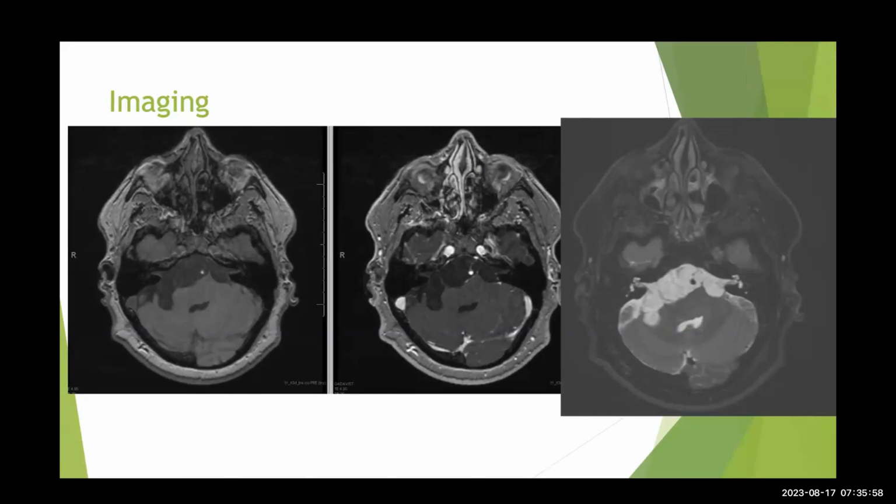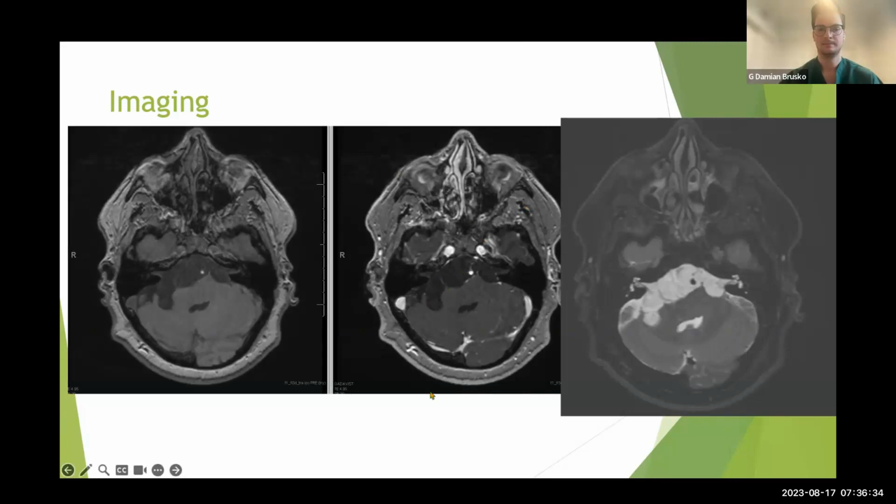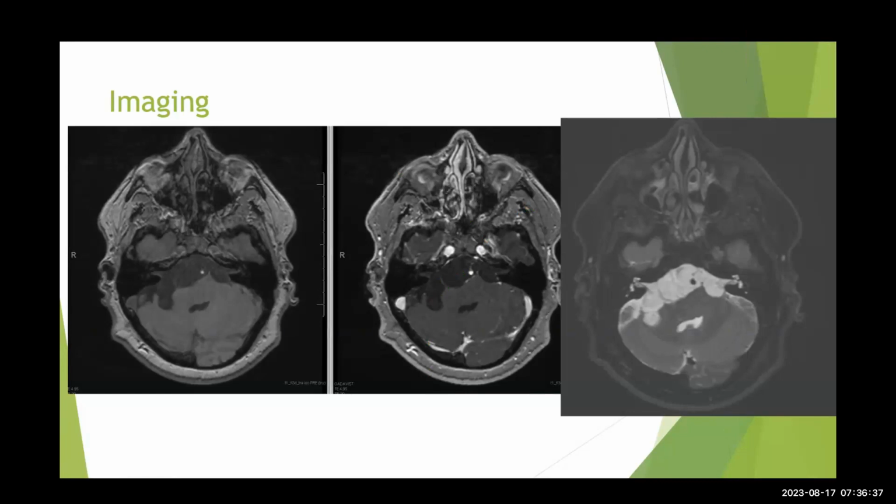So he has this isointense signal just anterior to the posterior fossa, anterior to the cerebellum. It looks consistent with CSF. It's not contrast enhancing. Questionable whether he has maybe an arachnoid cyst or some other cystic lesion. On the post-contrast it's a little more obvious, but it looks like he has some septations or a membranous component to it as well. So I think it looks a little more concerning for arachnoid cyst. There's obviously some mass effect, just a little bit, but nothing else that's really striking.